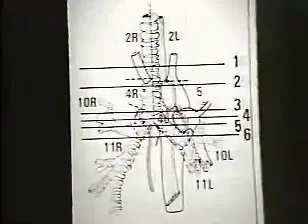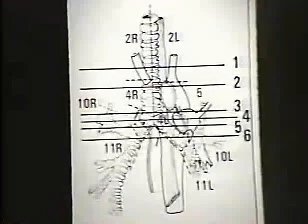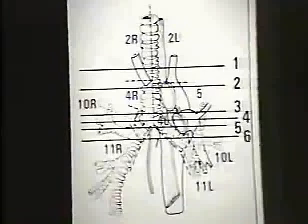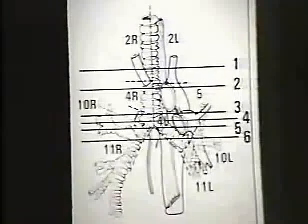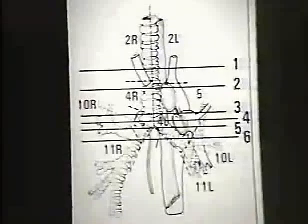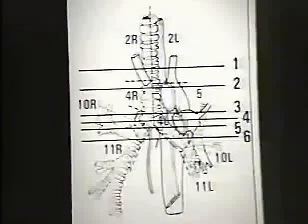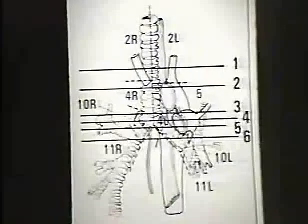Now let's take a look at this first diagram. This is a diagram of the important anatomic structures in the mediastinum that we will be considering. I want to draw your attention to the horizontal lines, which are numbered 1, 2, 3, and so on. The other numbers that you see represent regional lymph node areas, which we will be discussing in another videotape. These horizontal lines are potential areas that a CT scan may have been made through, representing a transverse slice of the body.